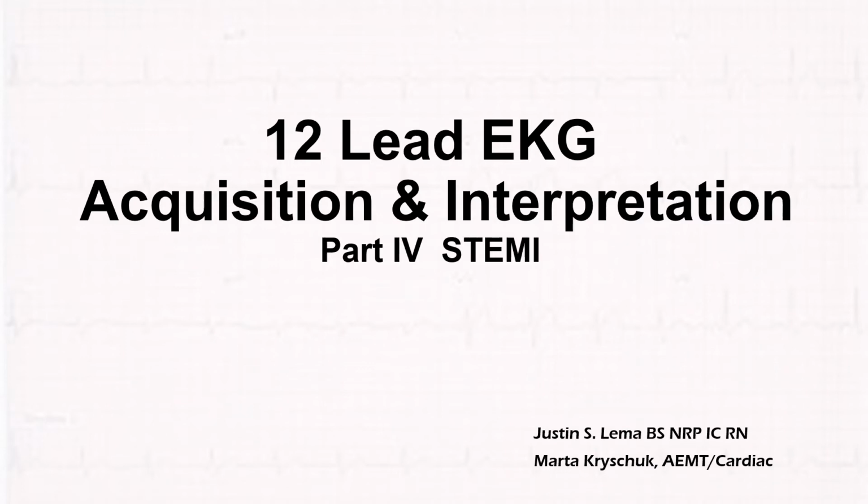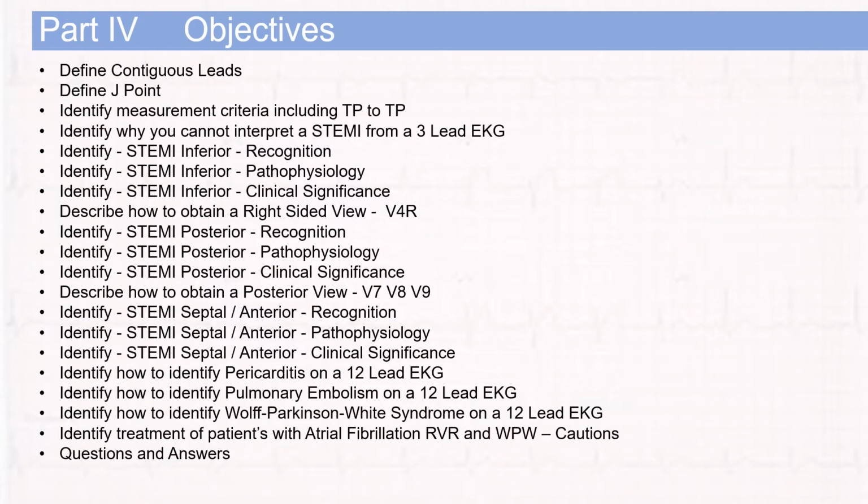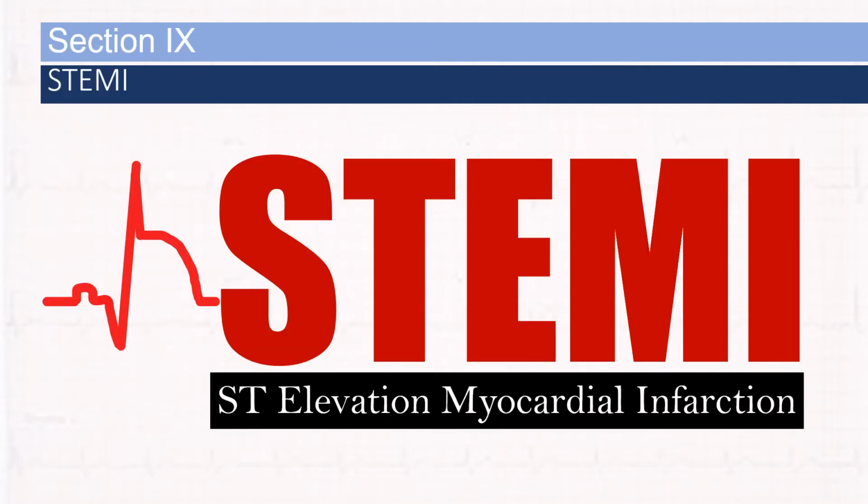Welcome to 12 Lead EKG Acquisition and Interpretation Part 4, STEMI. So here it is.